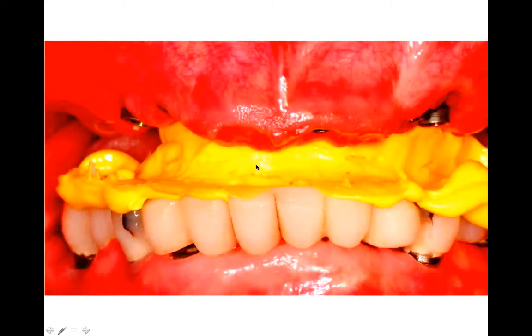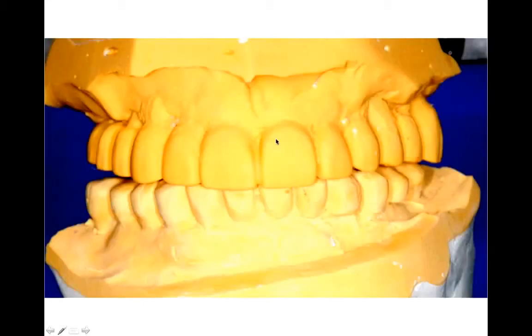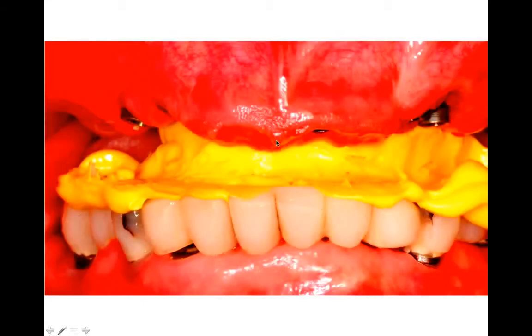So it's cross-referenced. In this case, this goes to the mouth. A bite is taken with those provisionals on, and then a whole bunch of material is injected up into the palate to form an index, because the palate tissue is attached and firm and doesn't move. So relatively speaking, this whole bite as one unit can be indexed back against the palate.